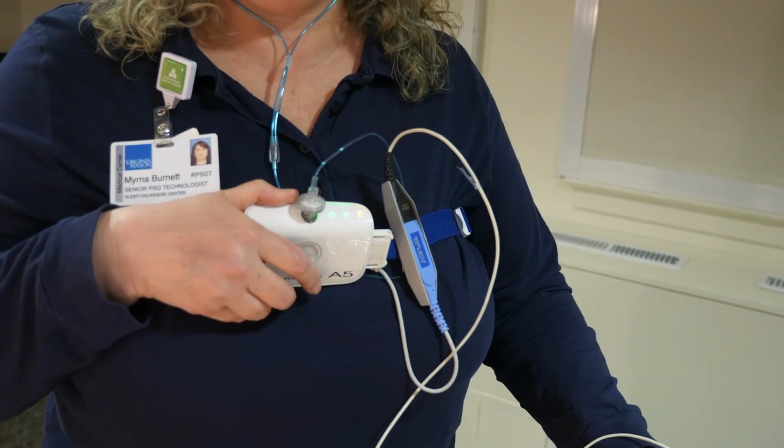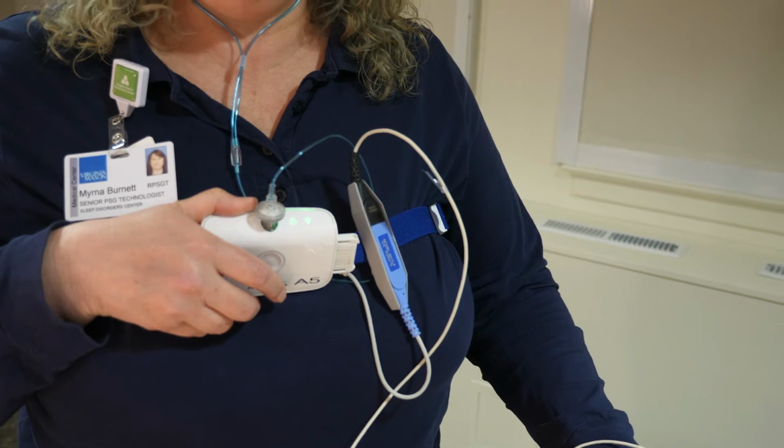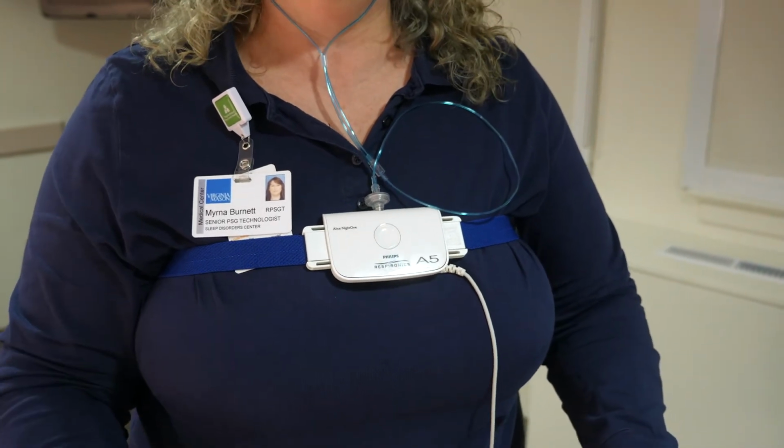It's sensitive, so just give it a couple of minutes once you've stopped moving around, once you've put it back into place, and it should go right back to green, and then everything will turn off. The unit has gone dark, everything is on, so you're now ready to go to bed. Try to get at least a 6-hour sleep study for us. That's important because we want to make sure that you get through at least 2 sleep cycles during the night so that it gives us an opportunity to see if you have sleep apnea, how it's affected in different stages of sleep, as well as any position changes that you may make in the night.